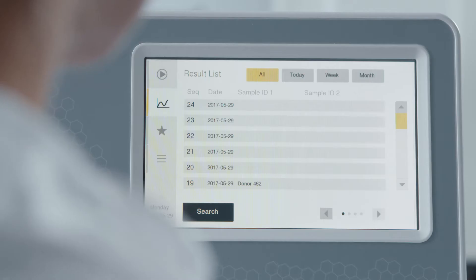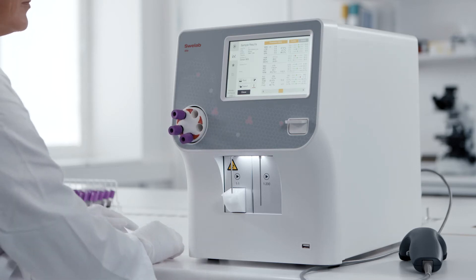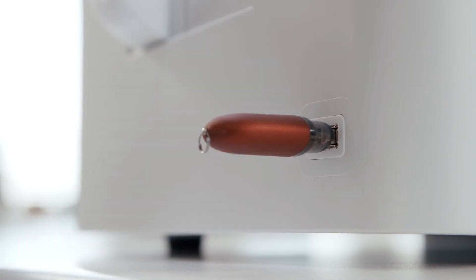Via the touchscreen menu, better connectivity and improved communication protocols are also key features of Swelab Alfa Plus. All models can be easily connected to a PC or USB, for example.